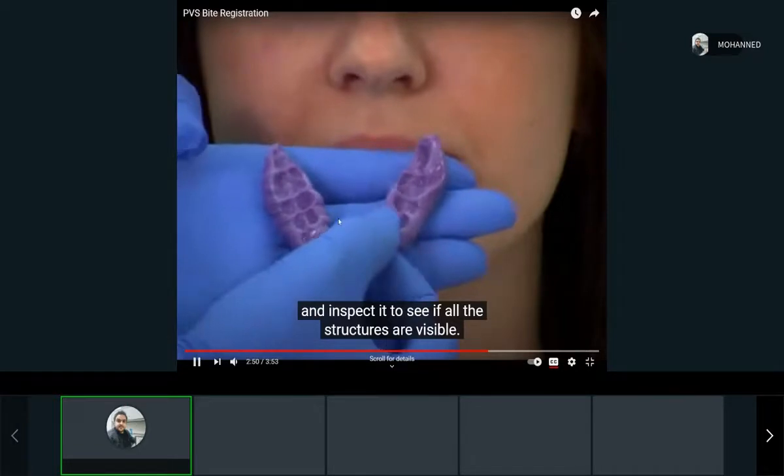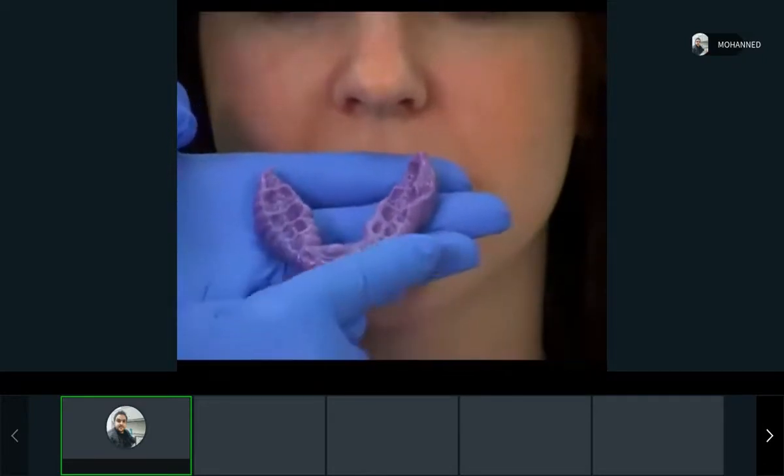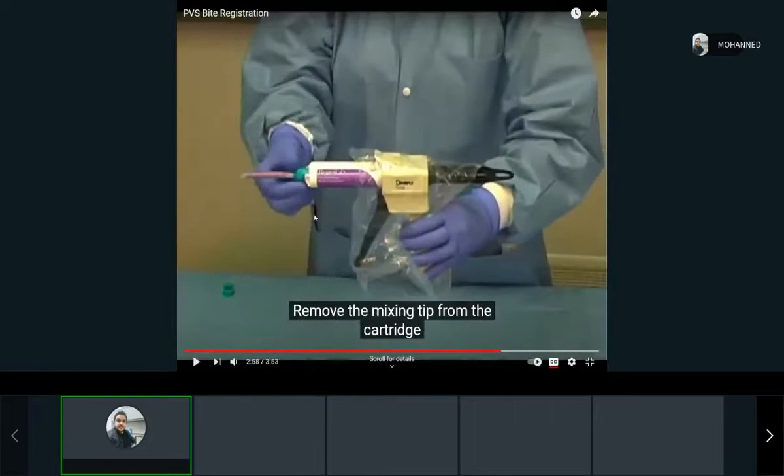It will not change. It will not gain water and swell, or lose water and dry, and so on and so forth. So it is a great material. You're going to work with it a lot, and we're definitely going to work with that in the lab.